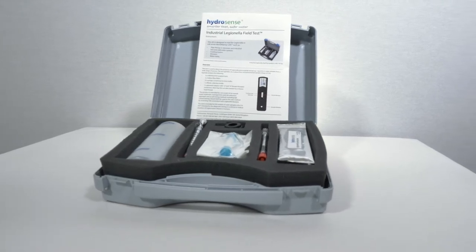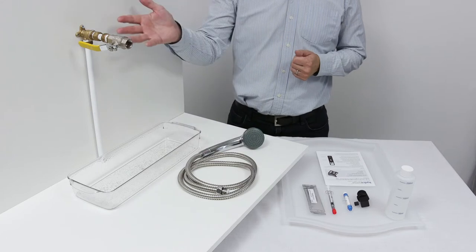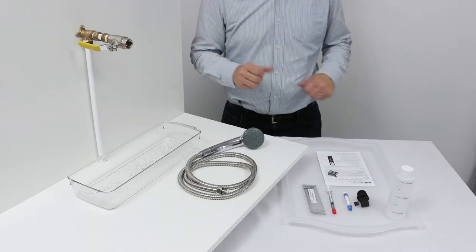The industrial field test kit has a number of uses. It can be used for sampling from a shower or from pipe fittings, and it's also suitable for cooling towers and hot and cold water systems where you have access to a pipe fitting.